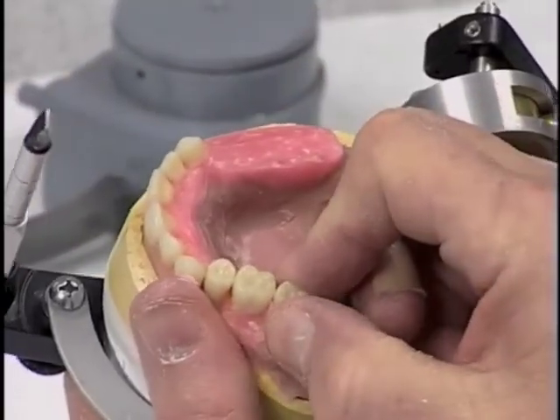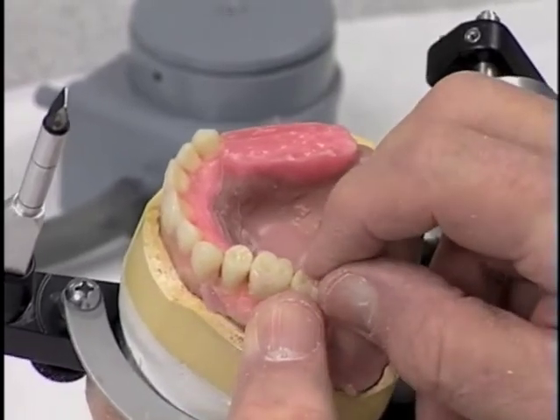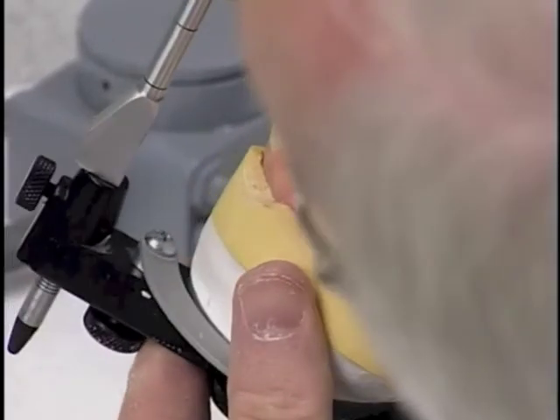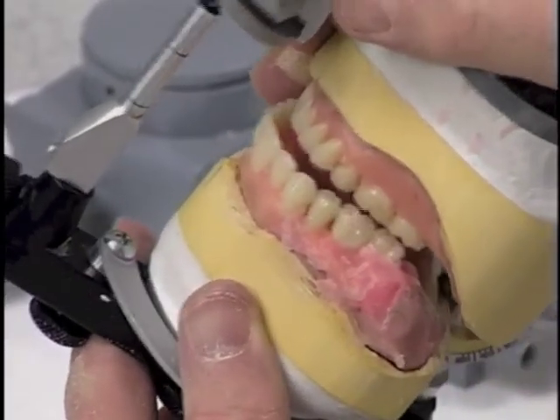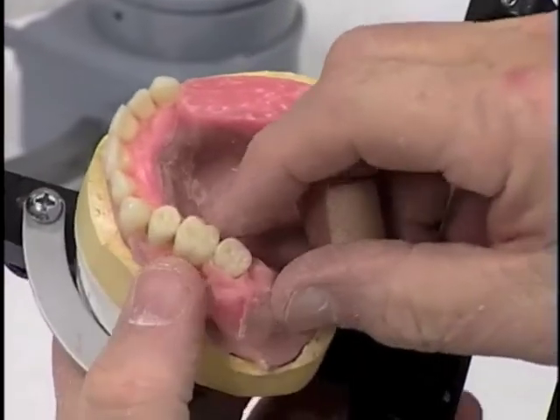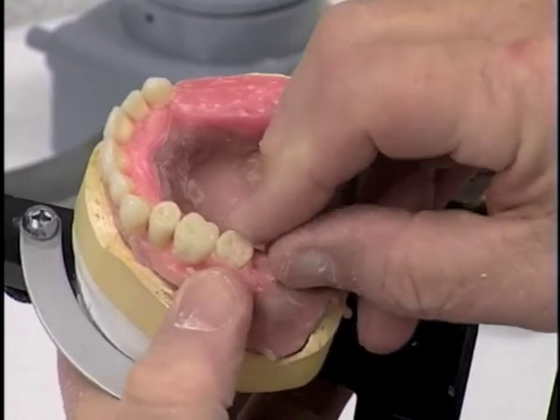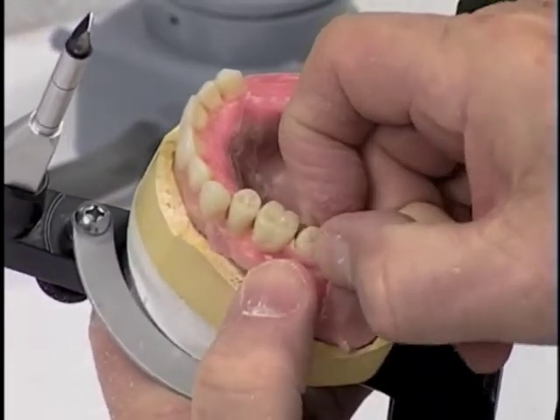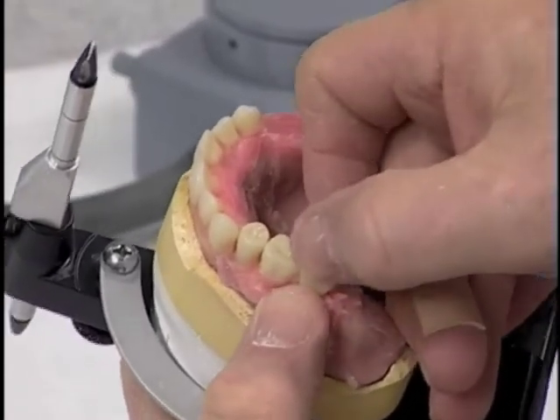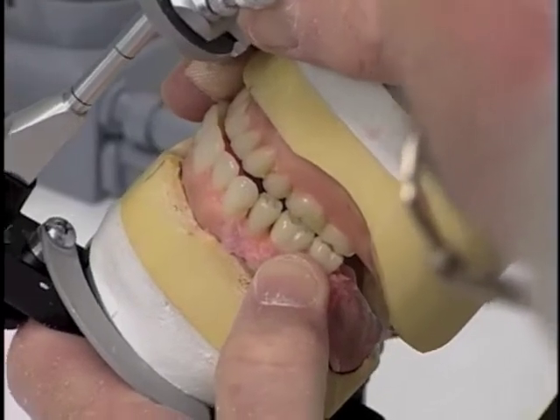That's in a little bit too far. We don't have any horizontal overlap to those teeth, so I'm going to rearrange them just enough to see if we can get nice horizontal overlap. It's still not enough horizontal overlap, so we need to move out the alignment of the first molar just a little bit and of the second molar just a little bit so that we can have a sufficient amount of horizontal overlap.